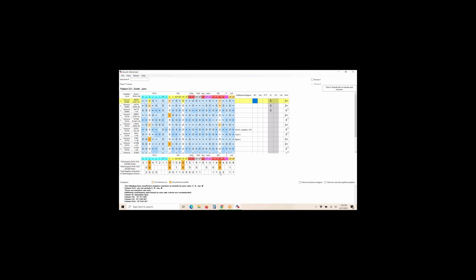It's an option, but we recommend you put it on there, but some labs don't want it on their sheet because they want the tech to just count it themselves. But this is a nice way that you can see how many cells have negative reactions. Like this is one of them. This is one of your cells. It didn't rule it out because it was single dose M, but it's counted down here as a negative reaction to heterozygous donor. So you have 3 of them, but you don't have any double dose. So if your lab allows single dose exclusion from heterozygous donors for M, then you won't need to run any more because you have 3 already.